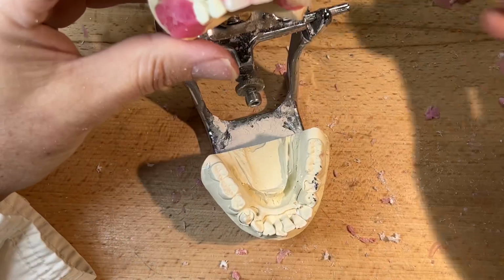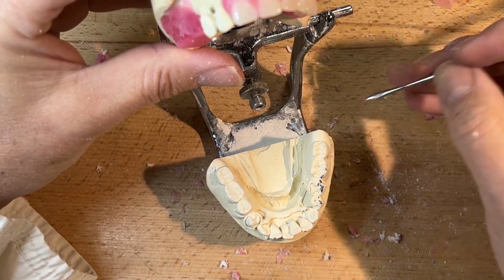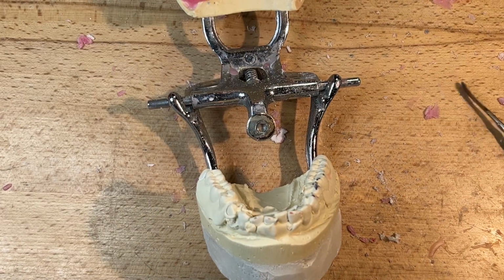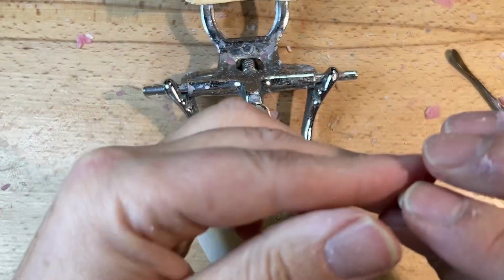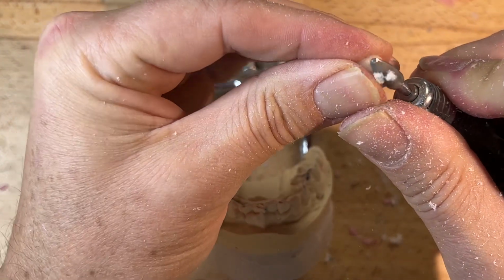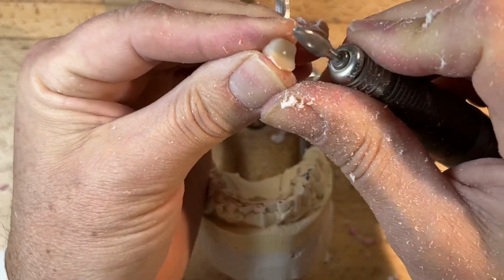And we've got the denture teeth here, and these look to me like a Vita lingual form, or even possibly a Vita MFT. And this is an interim denture. It'd be kind of nice to match these up with the final denture, but due to the B1 shade and the timing of this, we can go with these Yamahachi.